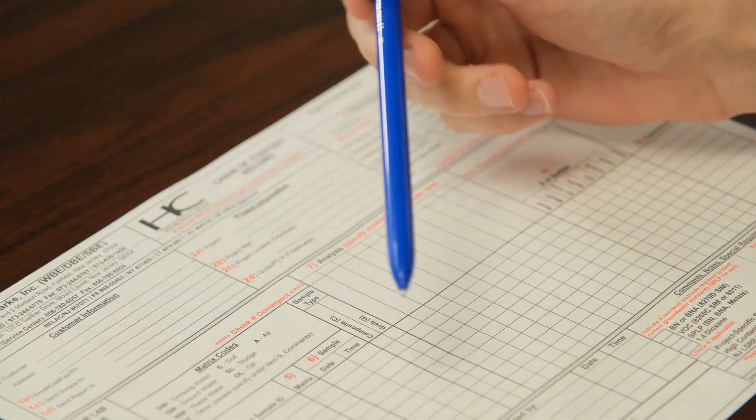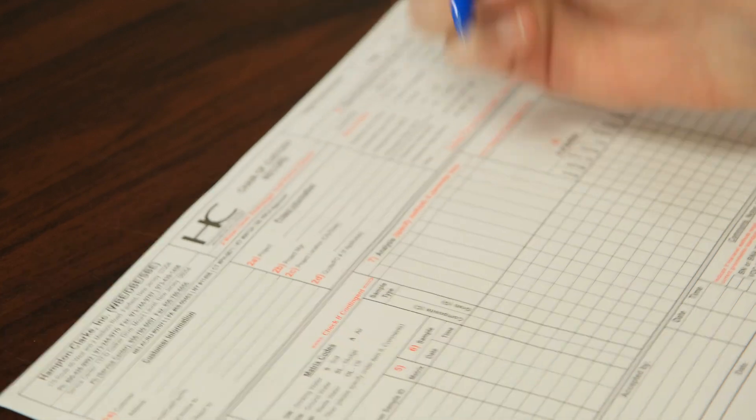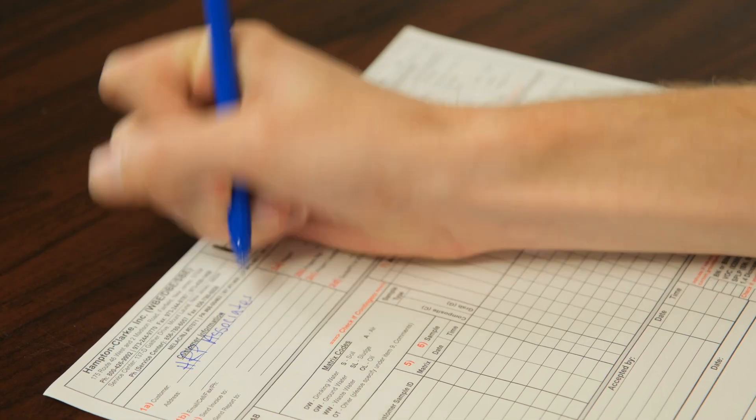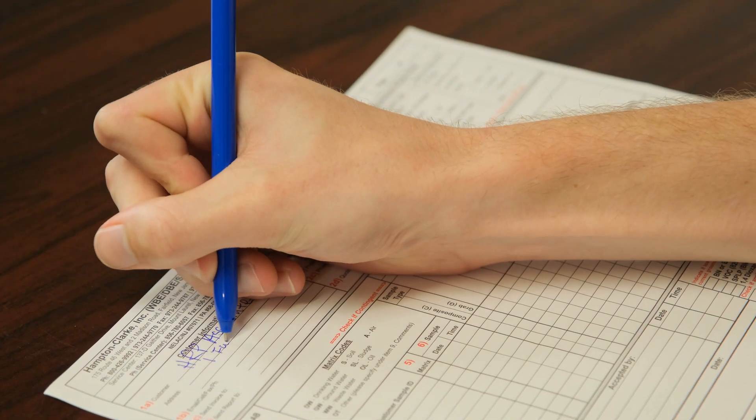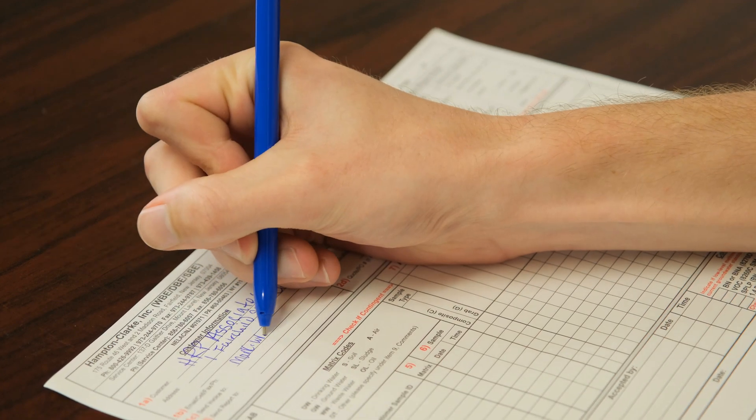Excellent, so why don't you show us now how to fill out the chain of custody. Sure. To start with, always want to use a pen — never use a pencil. You're going to want to fill out Section 1, which is basic customer information. This is all information about you, the sampler, and the company that you're representing. You want to make sure you put your office information in there — in this case it would be One Fairchild Square. You're going to want to put down any contact information; you always want to put down your project manager's information in case the lab needs to reach out.